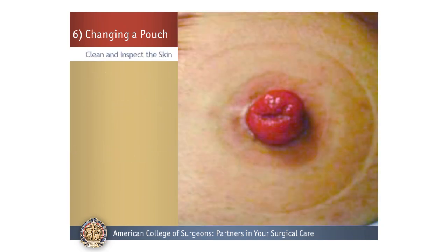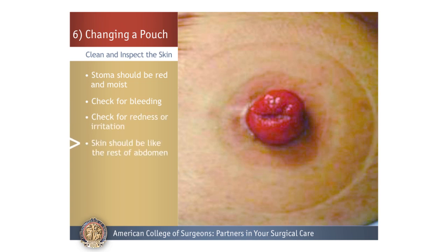Clean and Inspect the Skin: After removing the old pouch, look at your stoma and check the color — it should be red and moist. Also check for any bleeding; this is rare. Then check the skin around the stoma for any redness or irritation. Your skin should look like the rest of the skin on your abdomen.